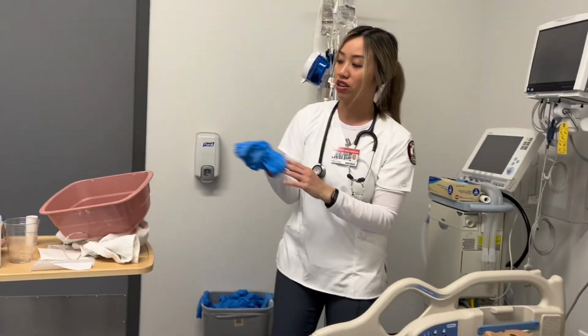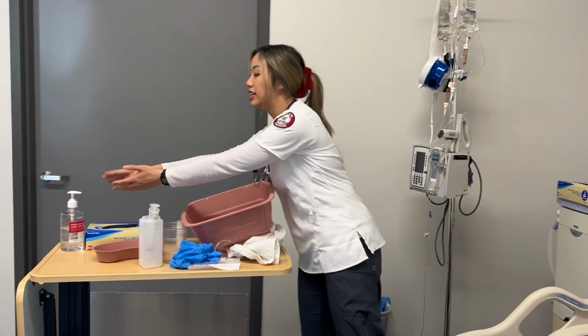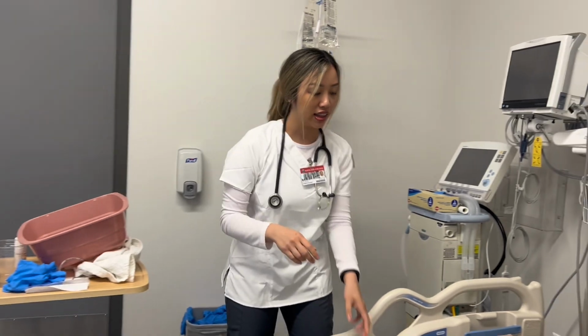Okay, and then I would doff my gloves. I would perform hand hygiene, and that would be it. Skill complete.